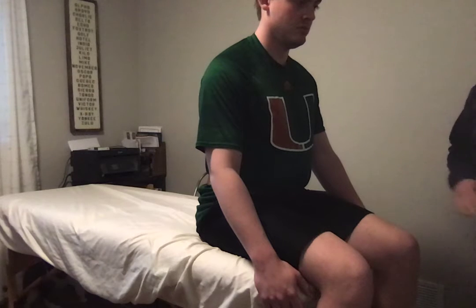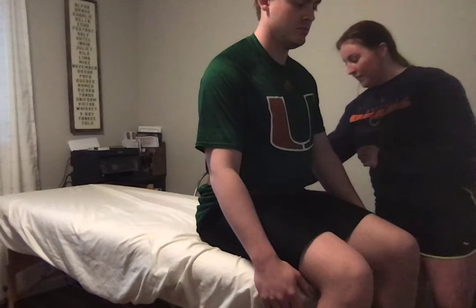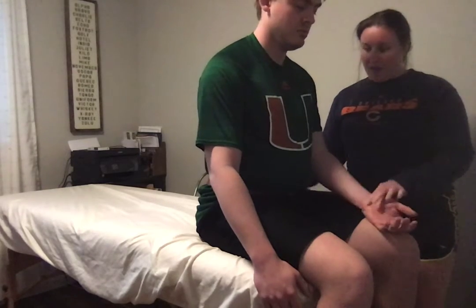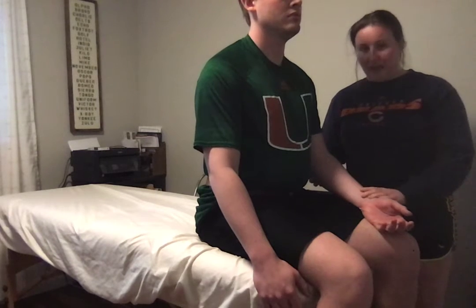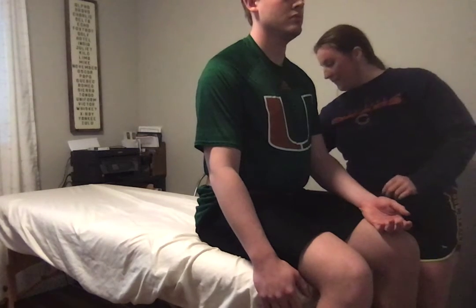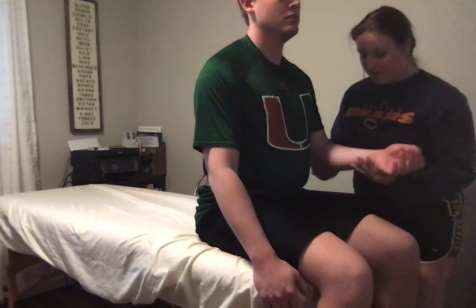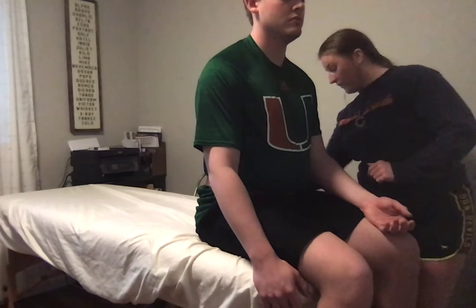For the biceps tendon reflex test, you want the patient to be sitting up nice and tall with their elbow flexed and supported, either by holding it or if they can rest it on their lap.